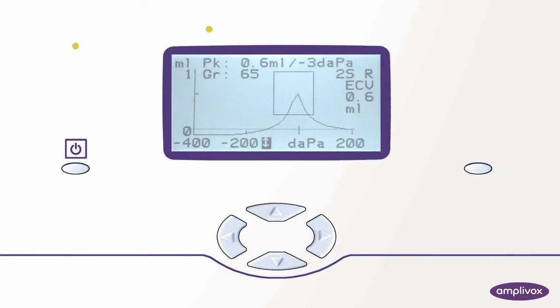After the measurement is successfully completed, we can review the test results on the display. First, we'll see the tympanogram and its additional information like the ear canal volume, the pressure and volume where the maximum compliance point was found, and the gradient.